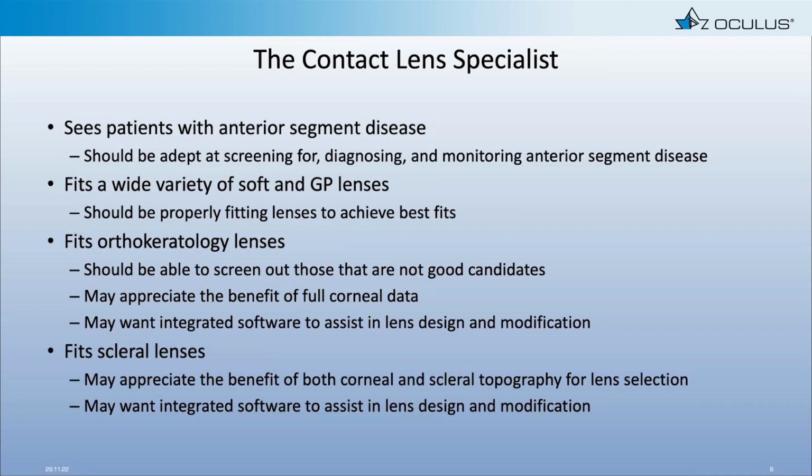Now, not everybody may be that way, but certainly if you want to practice at that very highest level and say to your patients that I'm fully confident in my ability to manage your corneal disease, your keratoconus, your corneal transplant, whatever that may be, it helps to have the instrumentation that is best at detecting diseases and monitoring for progression, et cetera.